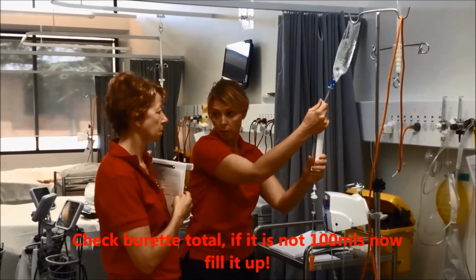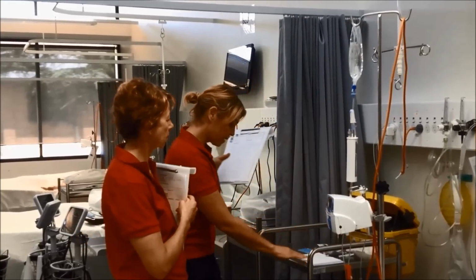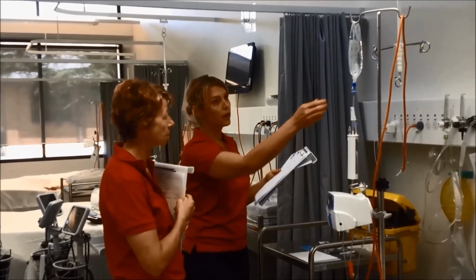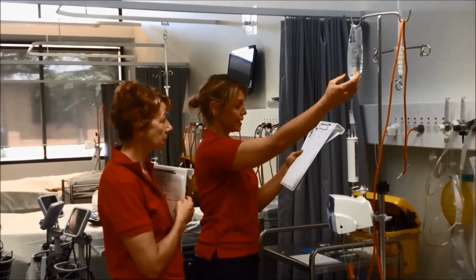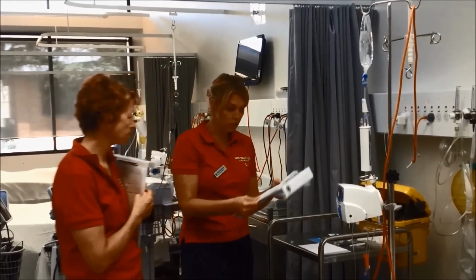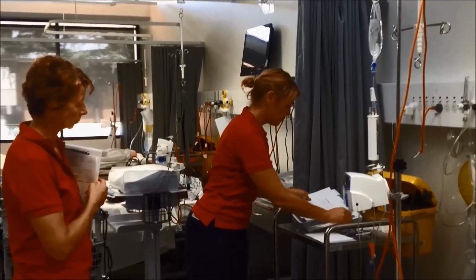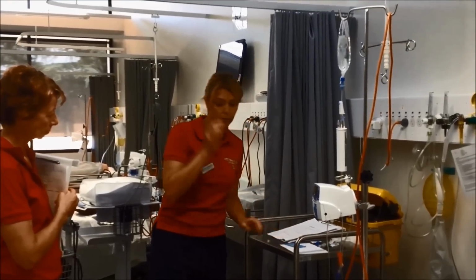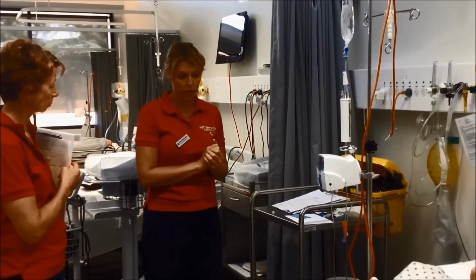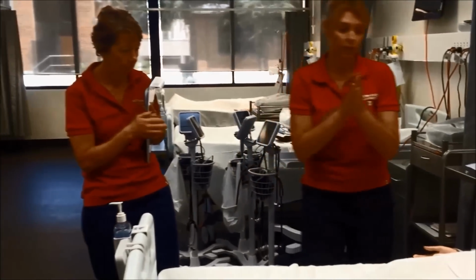It's a little bit short because I'm going to put my drug into there. Yep, so 100 mils. And that rate, I'm going to give 100 mils per hour. Yep, his expiry date is 10th month 2018. It's to be given IV, hasn't been given, and it's today's date. So that's my third drug check. Now I'm just going to go to my patient, do the second patient check, and then put the drug in, check his cannula site, and then can start it. Just wash my hands before I do that because I've left the patient area.